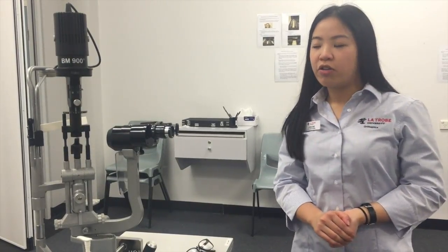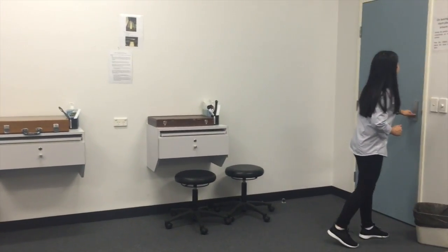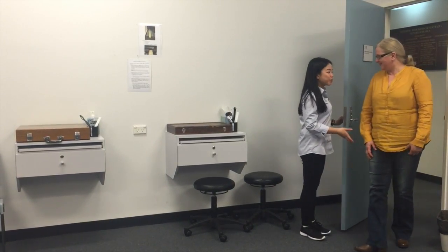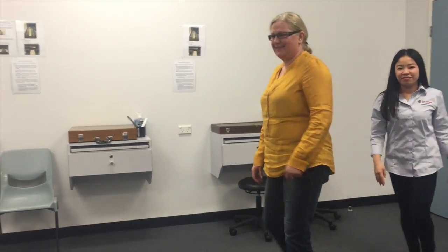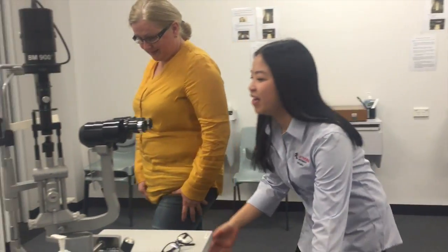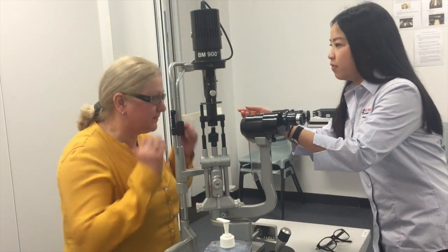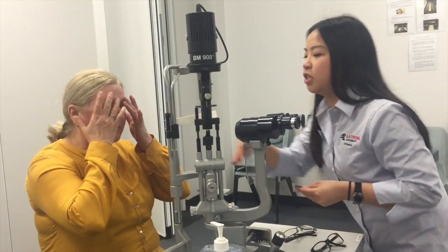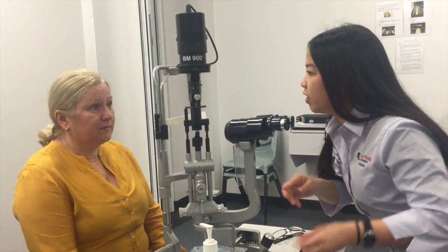I'll get the patient to come in so we can set her up as well. Hi Lily, how are you today? Thanks very much, I'm Christine and I'm your student orthoptist for today. I'll just take your glasses off for you and put them aside. I'll just clean up the chin rest and headrest while I do that.